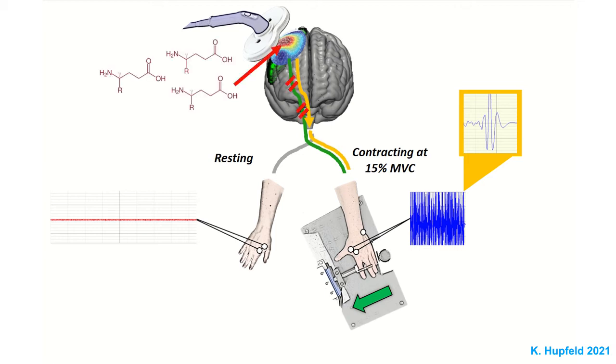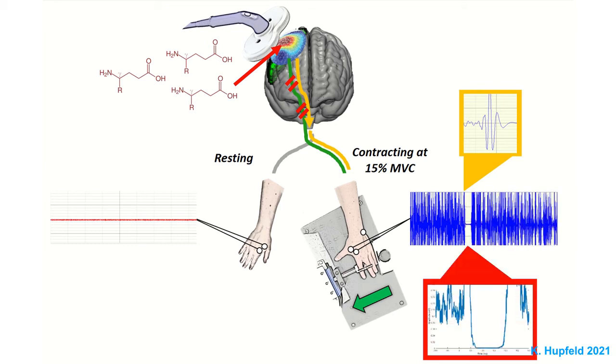Next, in response to this external TMS stimulus, we get an influx of GABA within the active primary motor cortex. GABA is the primary inhibitory neurotransmitter within the brain. This GABAergic response briefly disrupts the descending motor signal and ultimately causes a short silence in the EMG activity. This is your cortical silent period, or cSP.